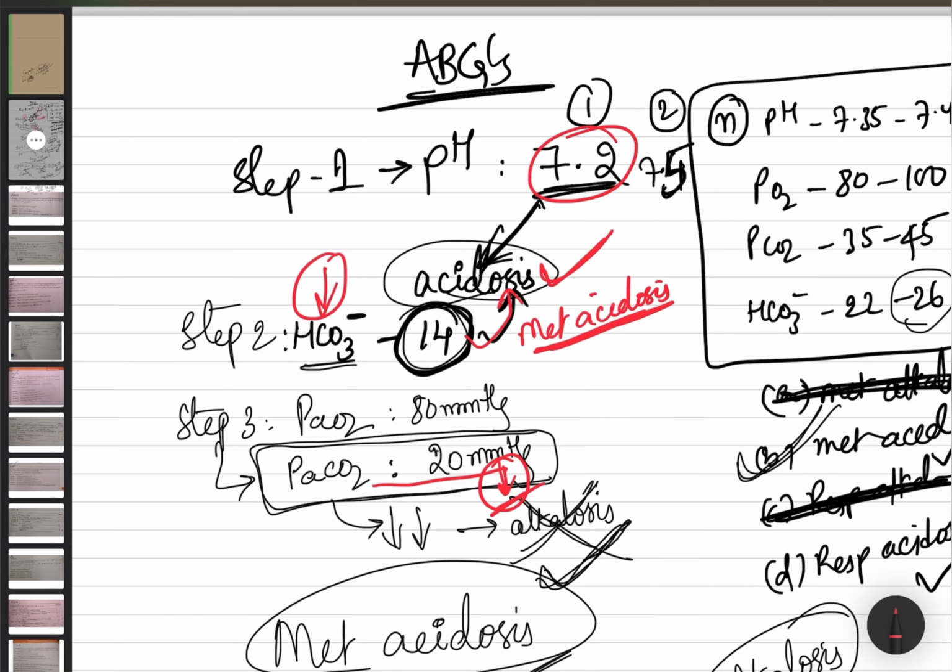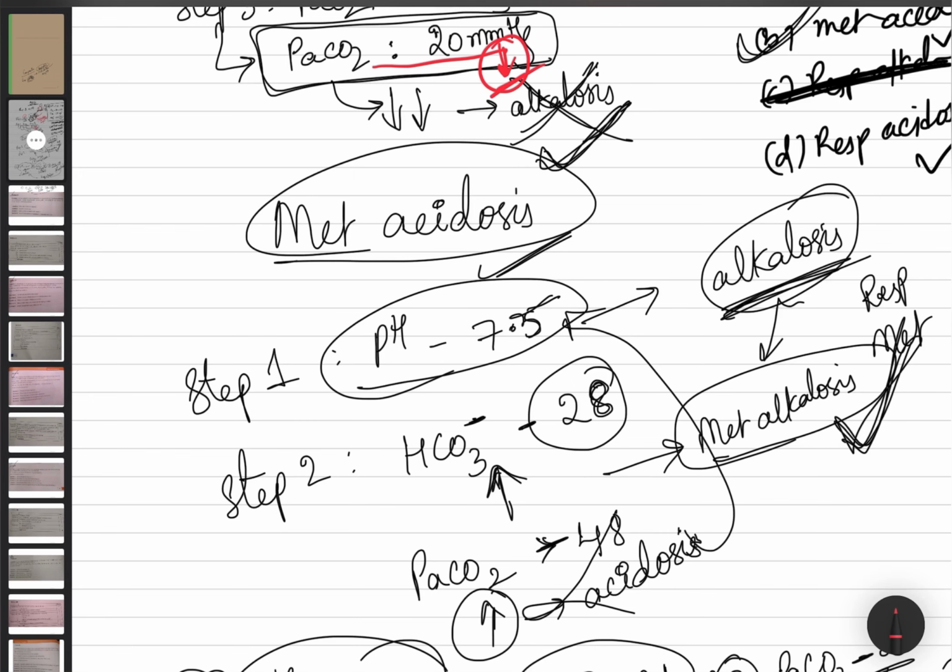You can also tell this diagnosis as metabolic acidosis with partial respiratory compensation. Okay. First you have to decide what this is, then you have to see the compensation. Firstly, if pH is abnormal, then the compensation is not full, it's only partial.